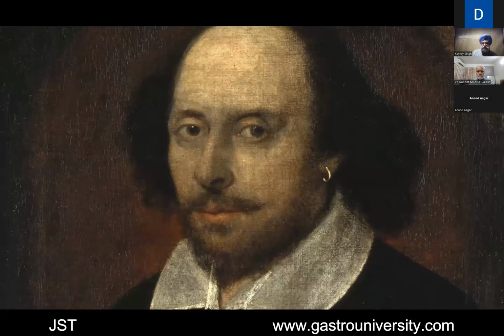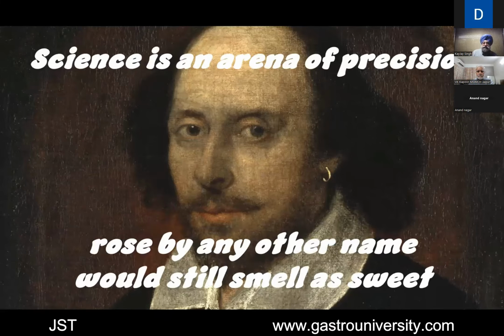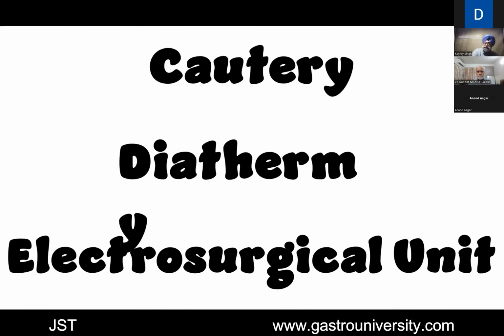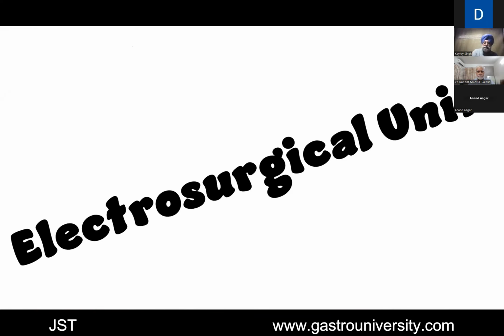This is William Shakespeare, who's known for his adages. A rose by any other name would still smell as sweet. But in science, we need precision. Cautery is a misnomer. It's not the right term for what we use. The three terms are cautery, diathermy, and electrosurgical unit. We are limiting ourselves to the correct terminology, and what we use is the electrosurgical unit, short term ESU.